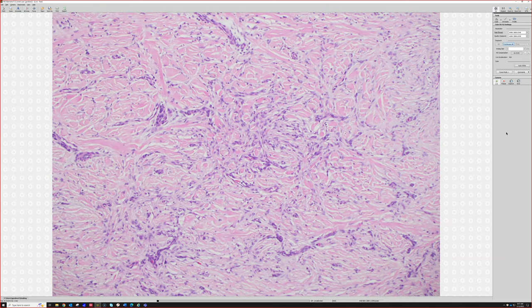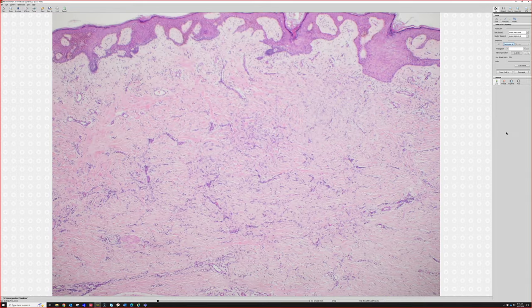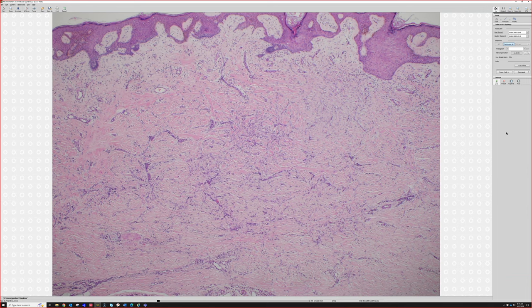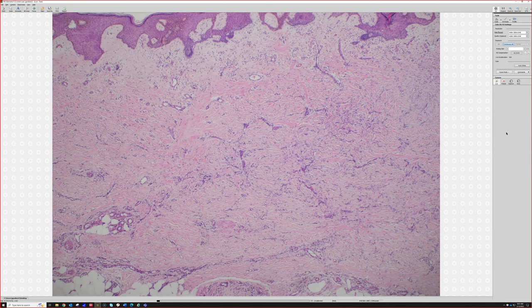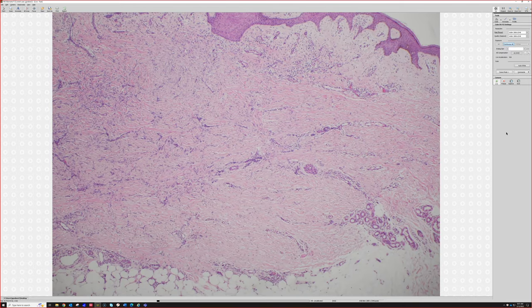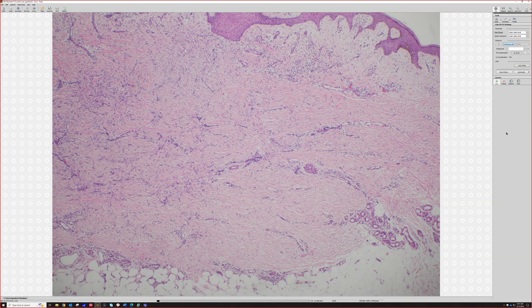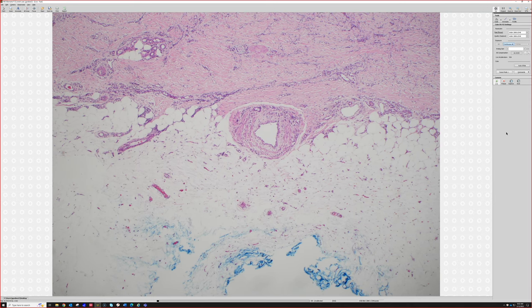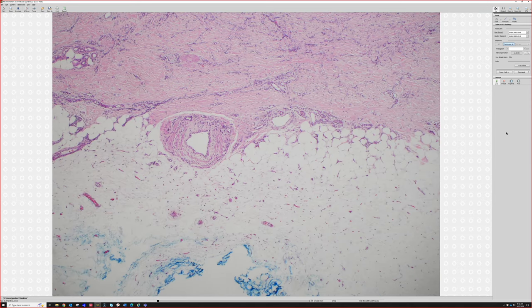The spindle cells can be bland and thin, or plump and a little atypical — the cytology can run the full range in dermatofibromas. You can have hypocellular sclerotic ones all the way up to really big cellular deep ones. Dermatofibroma has a huge wide spectrum. That's why you shouldn't go straight to the spindle cells — look at the pattern from low power, because the least important thing is usually the cytology. The most important things are what the epidermis is doing and how it interfaces with the underlying fat. That's a sclerotic example of dermatofibroma.